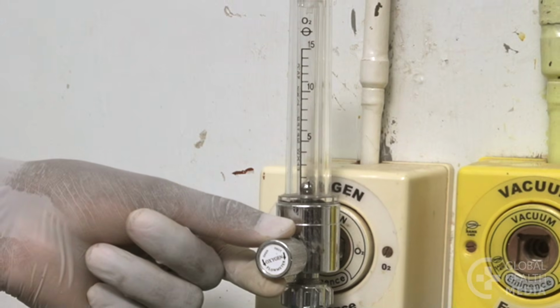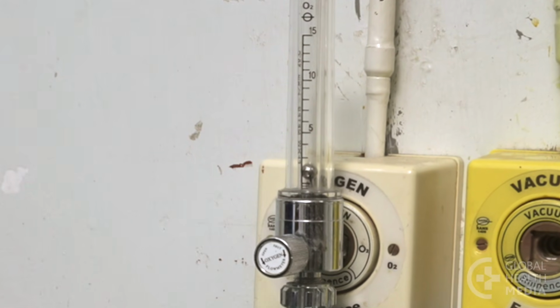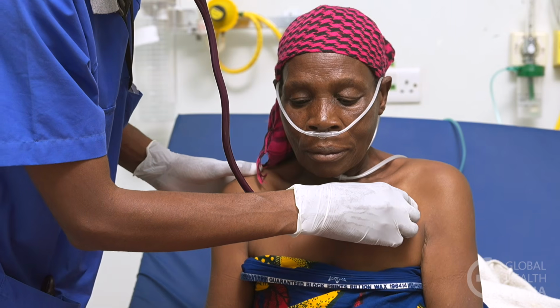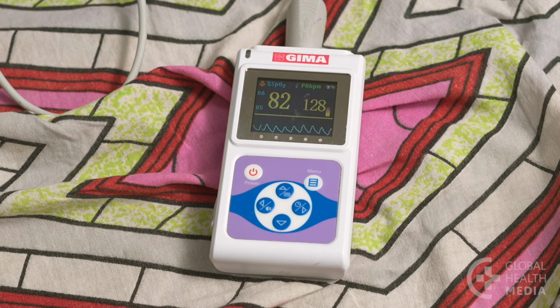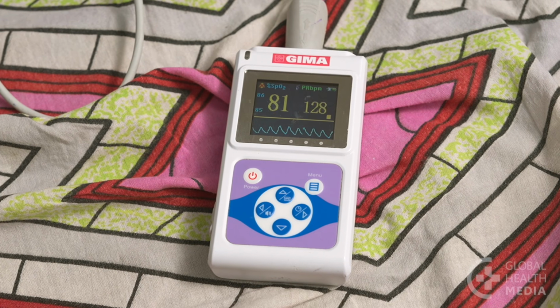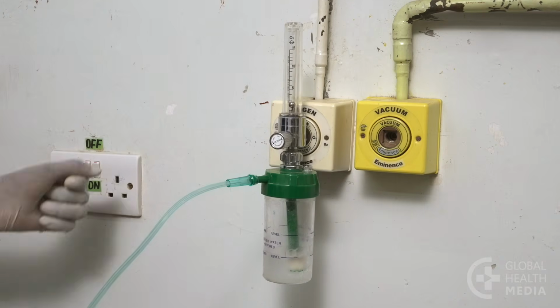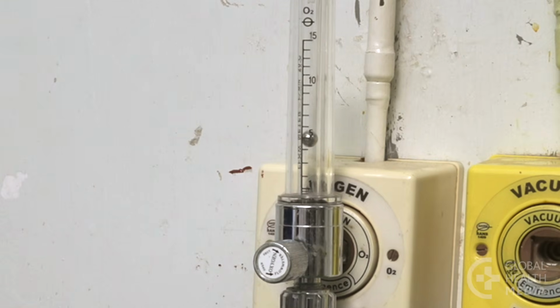Start oxygen at a low flow rate, 1 to 2 liters per minute. Monitor the patient for improvement in her breathing and the oxygen level. The goal is an oxygen level above 92%. If still low, increase the oxygen flow rate up to 5 liters per minute.